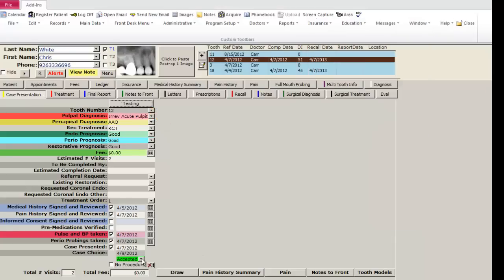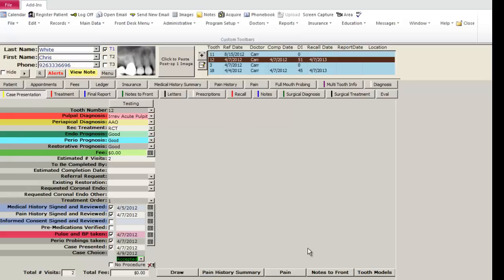Finally, at the bottom of this page, you can notate whether the case has been accepted, pending, or rejected. The next tutorial in the series will review the medical history in greater detail.